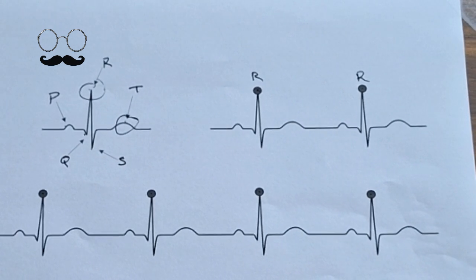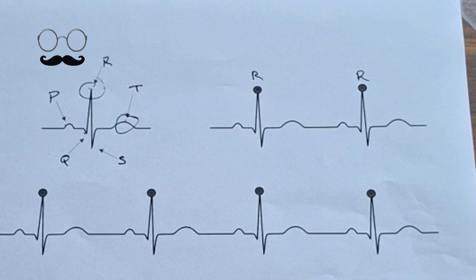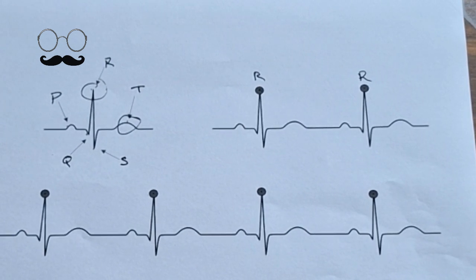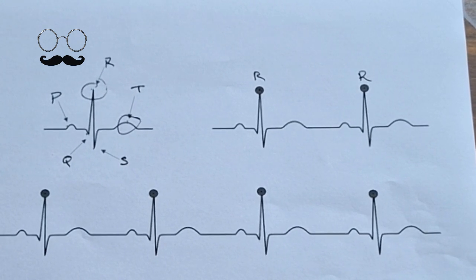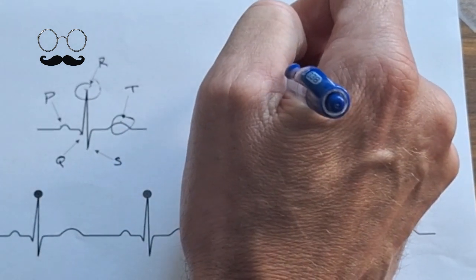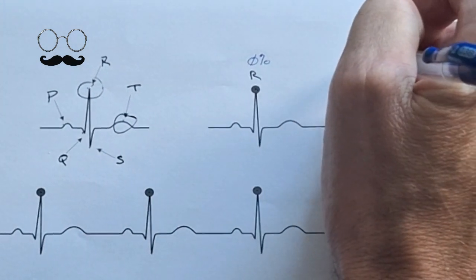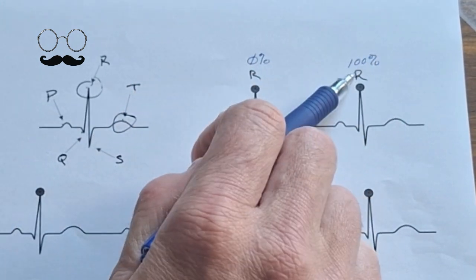And in cardiac CT, which is different from all other areas of CT, in this cardiac cycle, we have the ability to plant radiation where we want. Well, the scanner has to have some sort of way to know what numerical values would be assigned to that. The easiest way has always been percentage, because we always start with 0%. And if we end anything, we end it in 100%. So now we have 0 to 100.